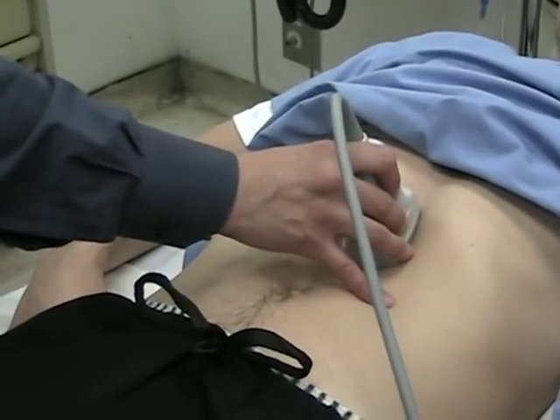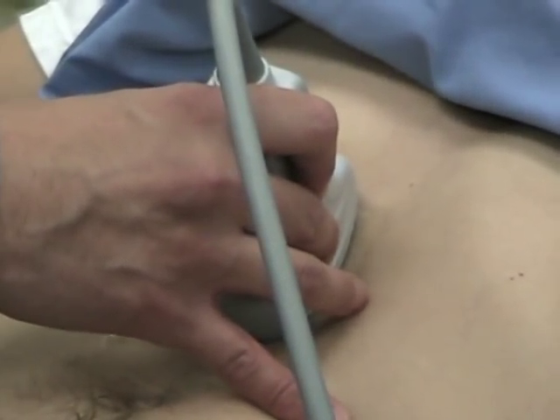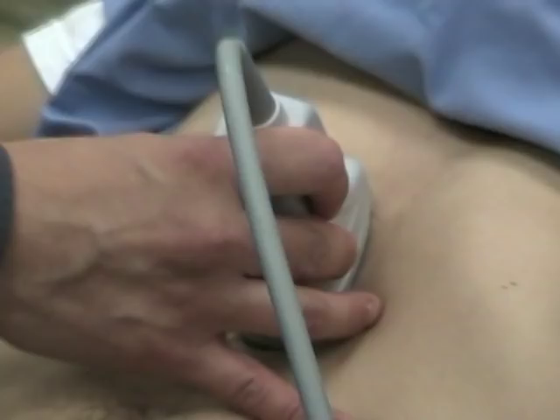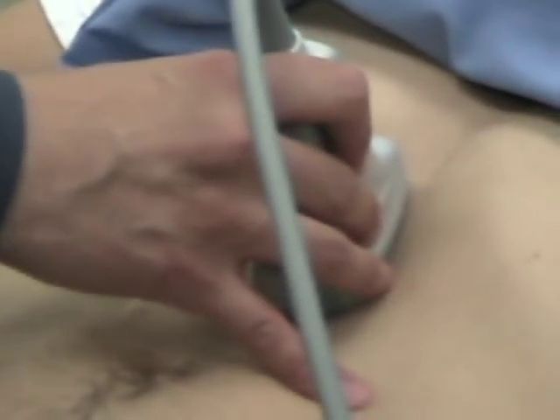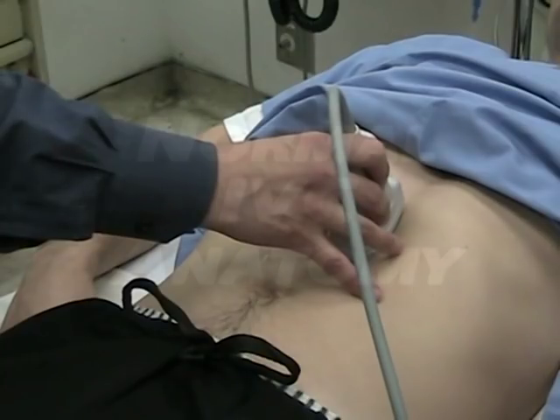What Danny's doing here is he's taking a curvilinear 3 to 5 MHz probe, aiming the indicator towards the head, placing it just under the xiphoid process, and then sliding one to two centimeters to the patient's right. So the probe goes just under the xiphoid, slide one to two centimeters to the patient's right, and you just tilt towards the heart.